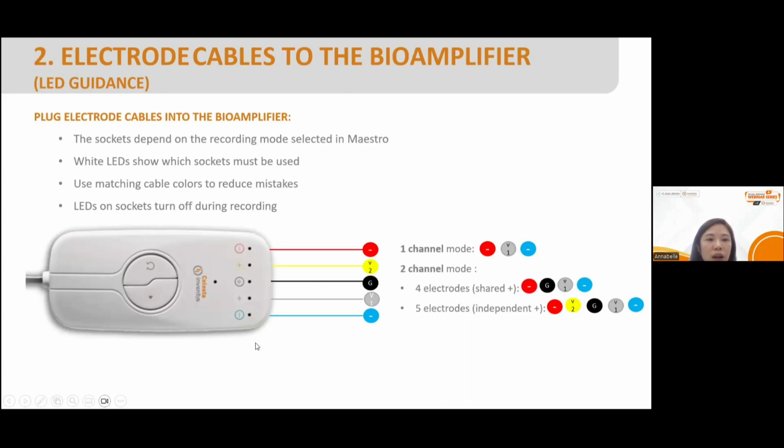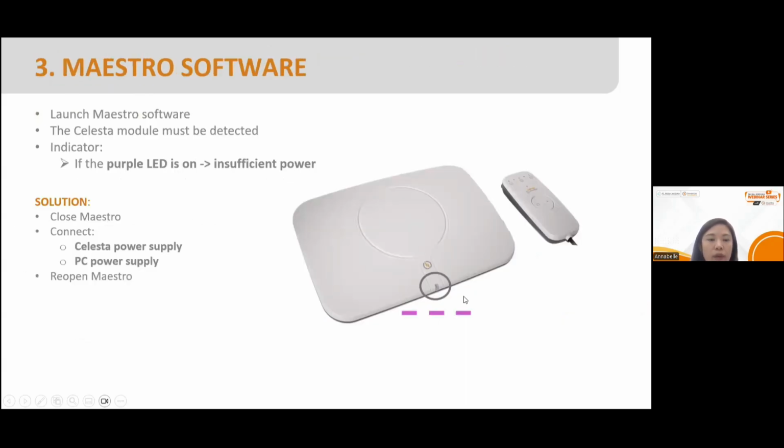This is the guide on how to check the LED lights, and some troubleshooting: if you see the purple blinking light, it means the battery power is not sufficient.